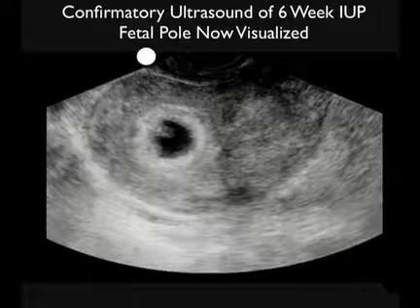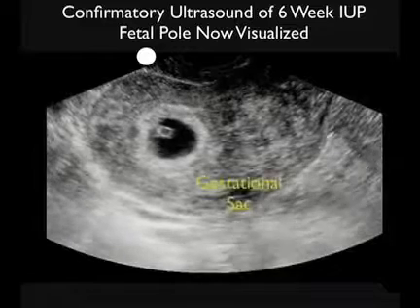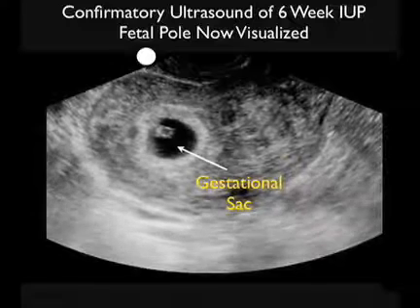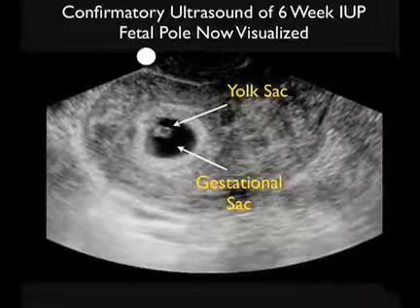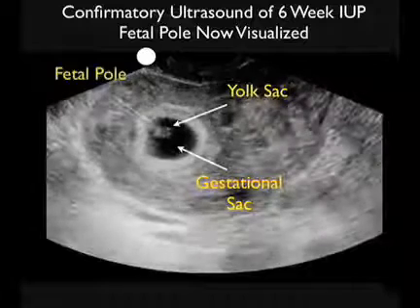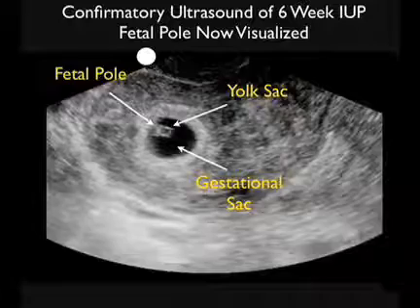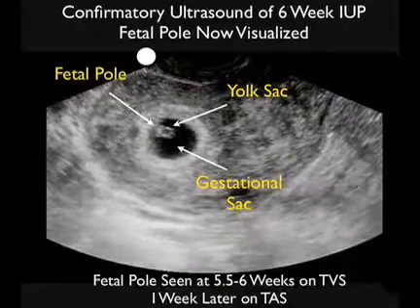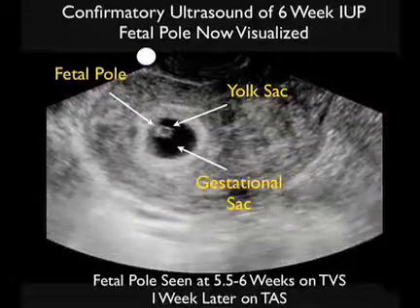Here's a pregnancy that's a little bit more advanced, and here we see a large round gestational sac, that dark or anechoic structure, and inside the gestational sac we can see the circular yolk sac or Cheerio sign. And let's look just to the left of the yolk sac here, and now we appreciate the presence of a tiny fetal pole. Interestingly enough, when we magnify the fetal pole, we could actually see a tiny heartbeat. Now, the fetal pole is generally seen at about 5.5 to 6 weeks on transvaginal sonography and 1 week later on transabdominal sonography.